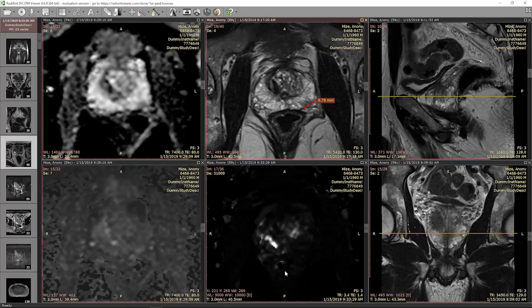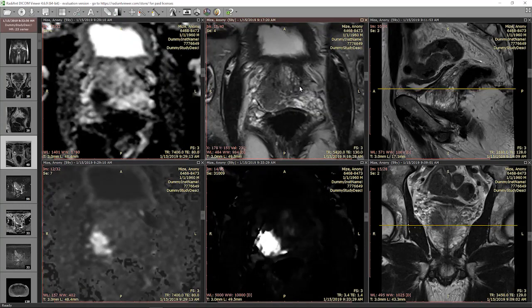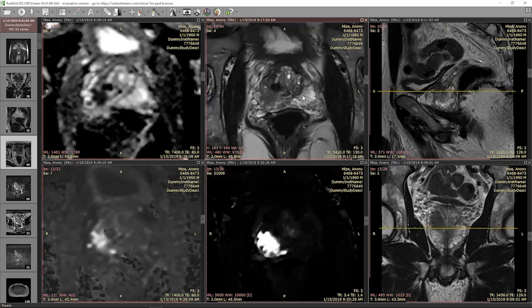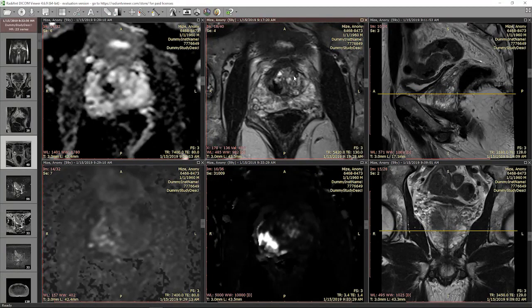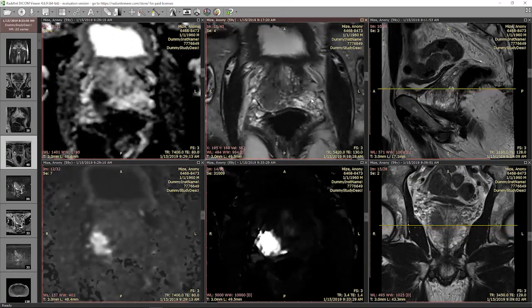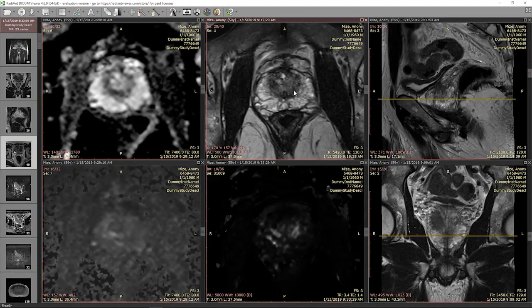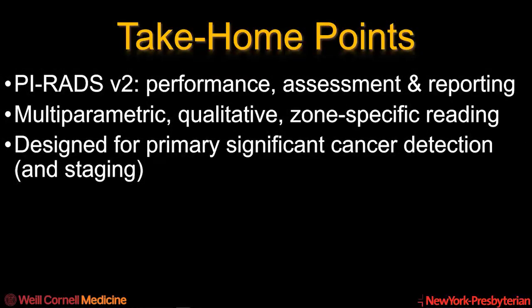One last thing to observe: here's an encapsulated lesion at the base — T2 category 2. Importantly, if you see an encapsulated lesion with markedly hyperintense DWI and hypointense ADC, if it's truly encapsulated it remains category 1. However, with PIRADS 2.1, if it's just circumscribed — not fully encapsulated — and is markedly hyperintense on DWI and markedly hypointense on ADC, that will be upgraded to overall category 3.